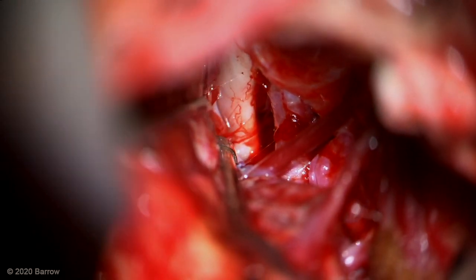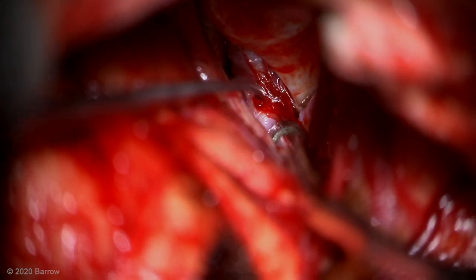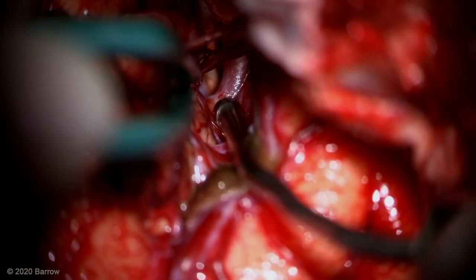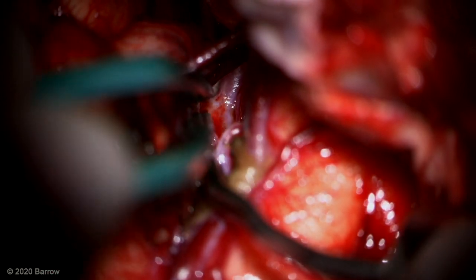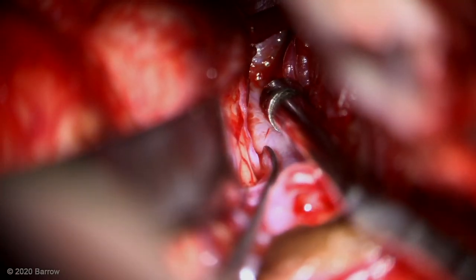The optic nerve is brought into view. The supraclinoid segment of the carotid artery is also brought into view. And now we begin to see the aneurysm base.